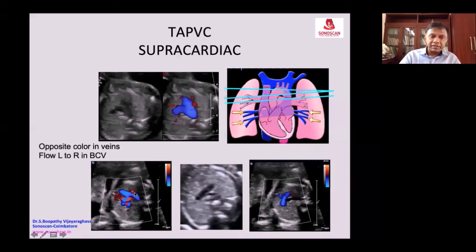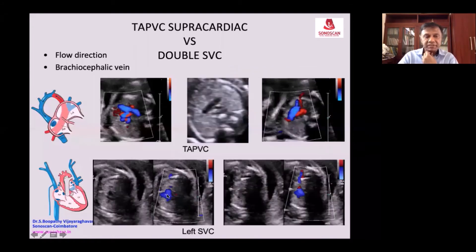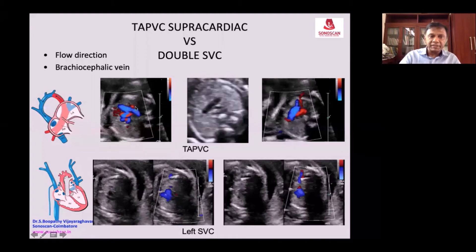The anomalous vein on the left side is appearing. The differentiating point is the flow direction: in TAPVC it will be opposite colors, whereas in double SVC it will be the same color, depending upon the tilt.